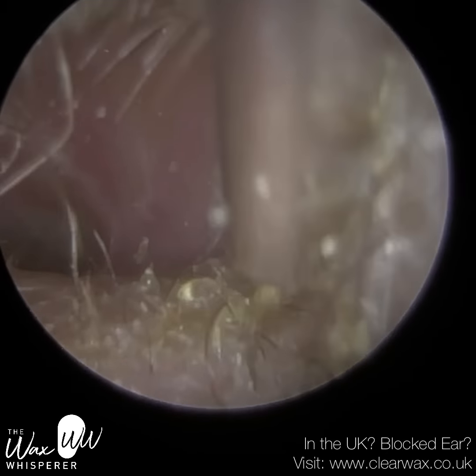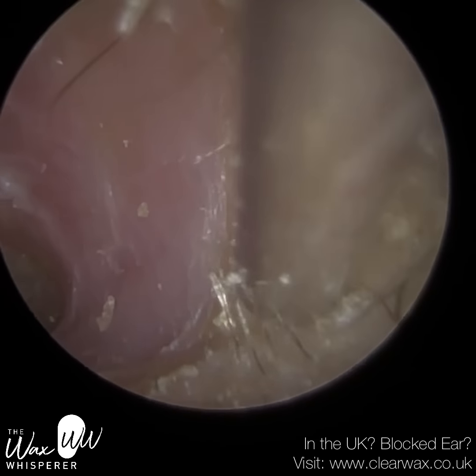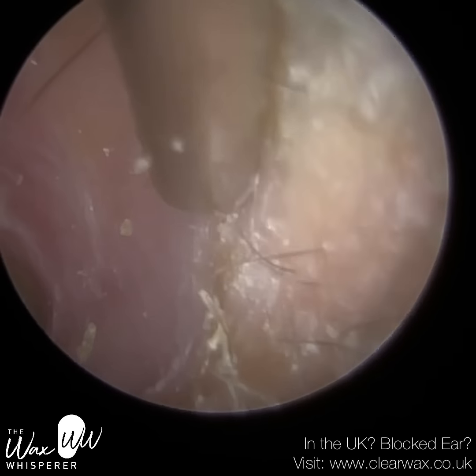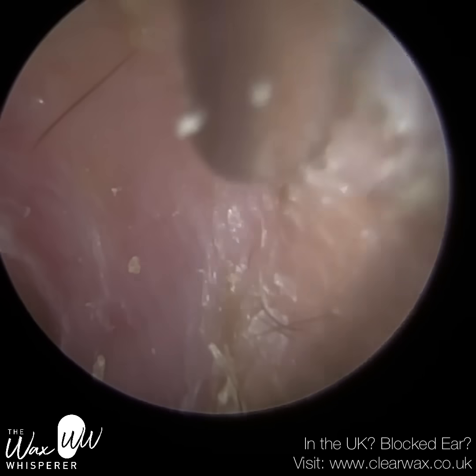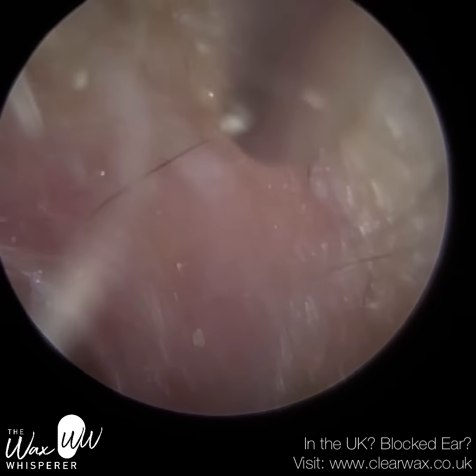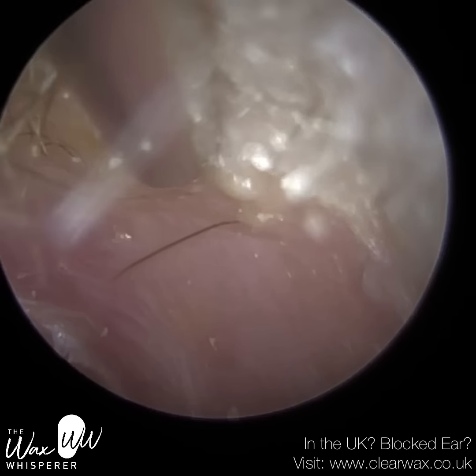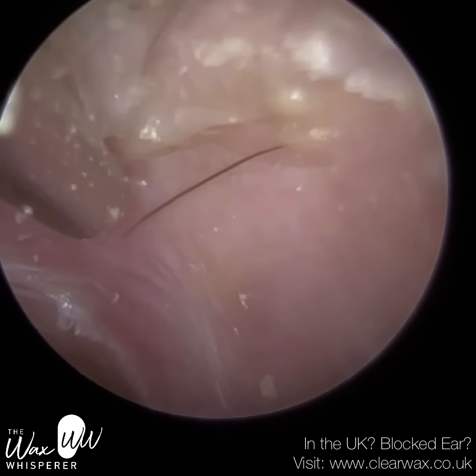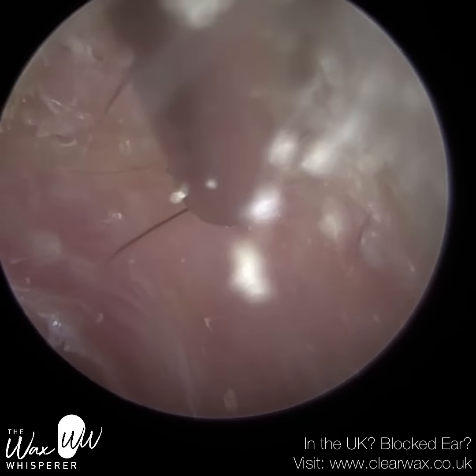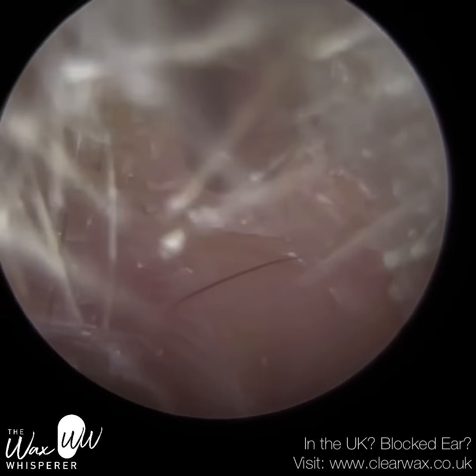And also the balloon itself, as it's inflated, will compress against some cells that are lining the eustachian tube, which are slightly inflamed, and you're hoping that the balloon almost kills those cells, and when it reheals, you don't get that inflammation. But another approach is to put a permanent T-tube in there, like what's happening with this patient. Now, that's really helped the patient in terms of their hearing. They're not suffering from a blocked eustachian tube and the symptoms, as I described earlier, that can arise if you've got a blocked eustachian tube.